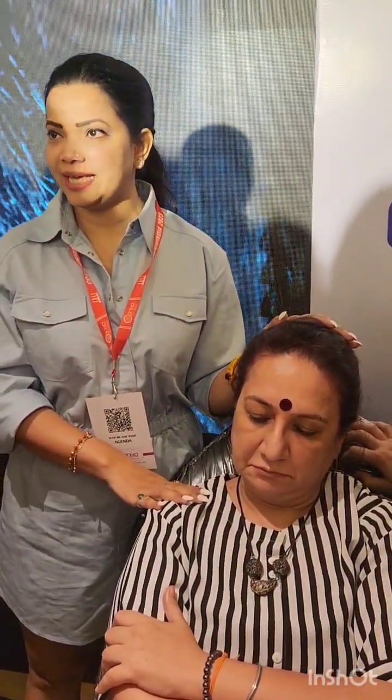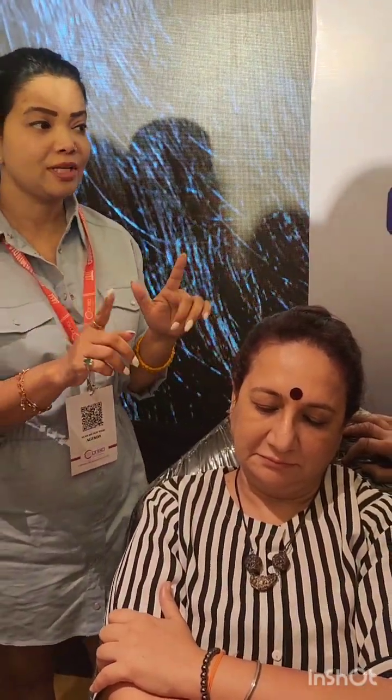The patient will start wincing, ouch. For thread, there is no ouch. When you are entering, it's very comfortable. There will be just a traction force. You will feel that something is cracking through and you are passing through that tissue. Okay, but there will be no pain. If there is a pain, that means you are into muscle.